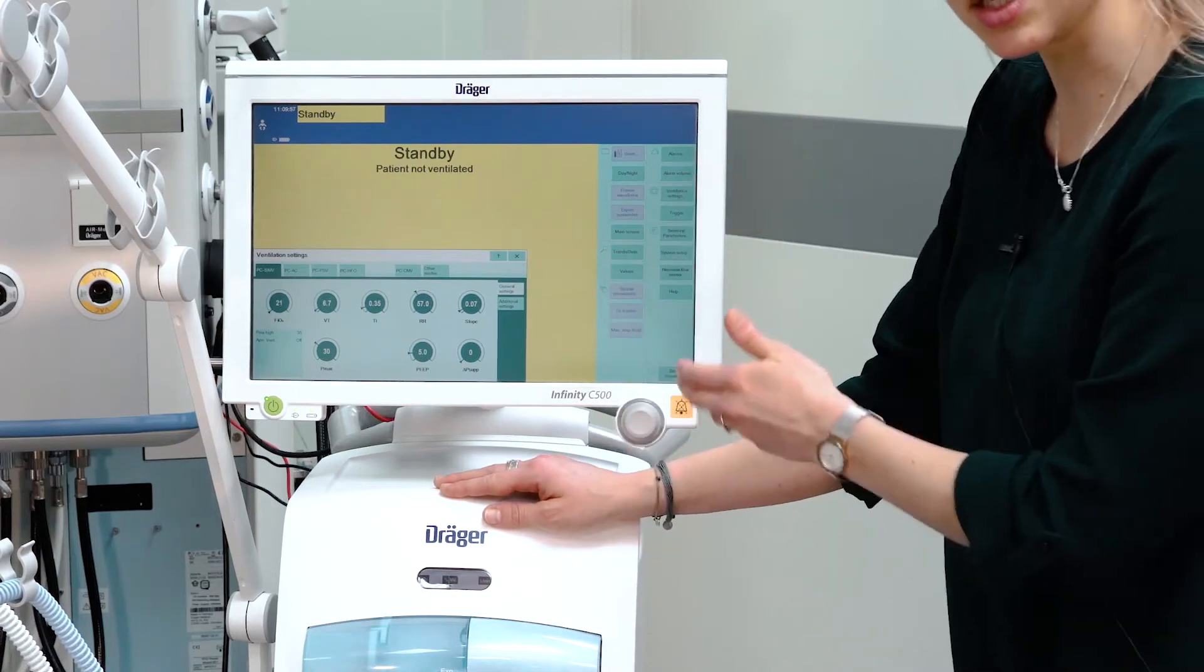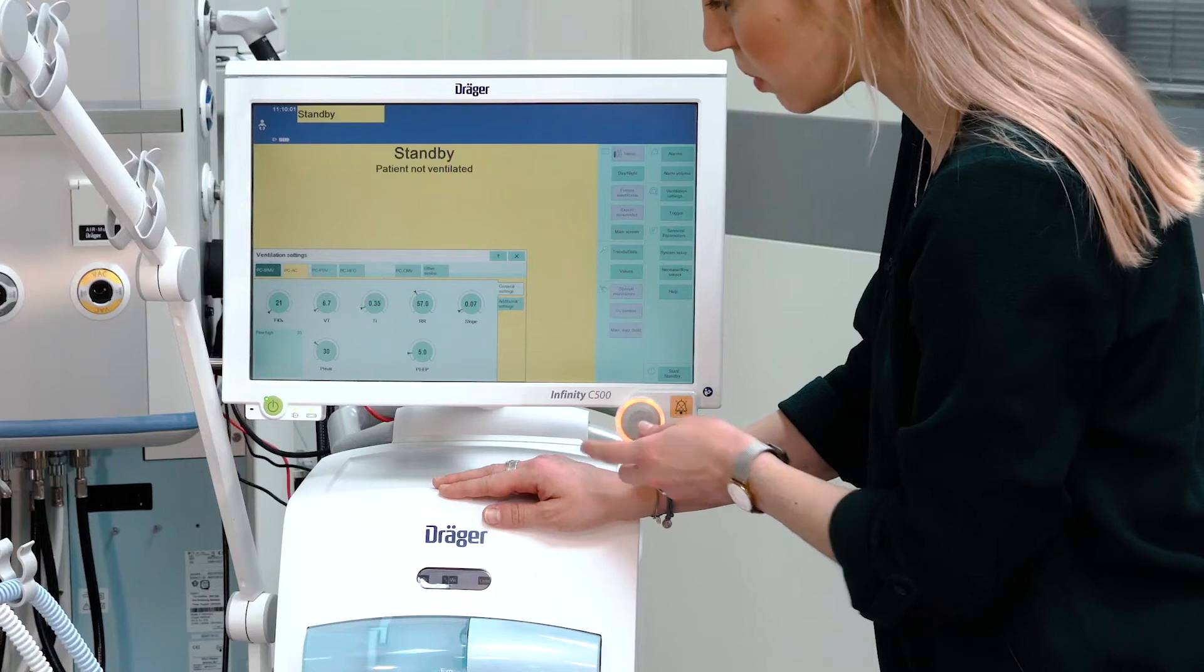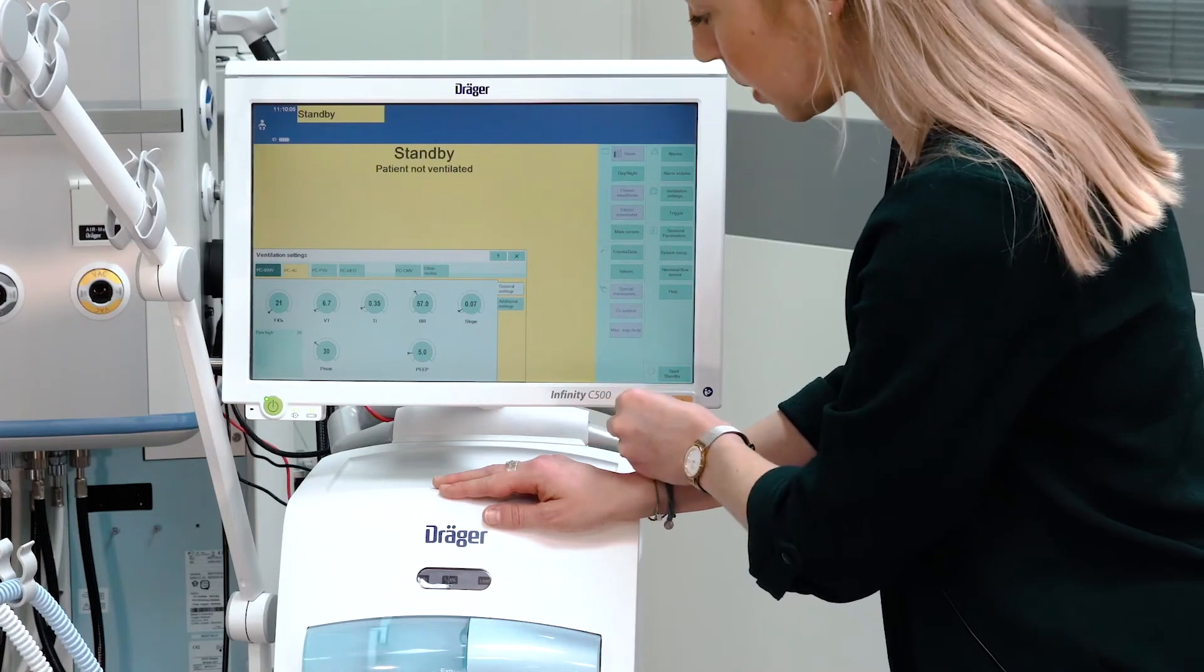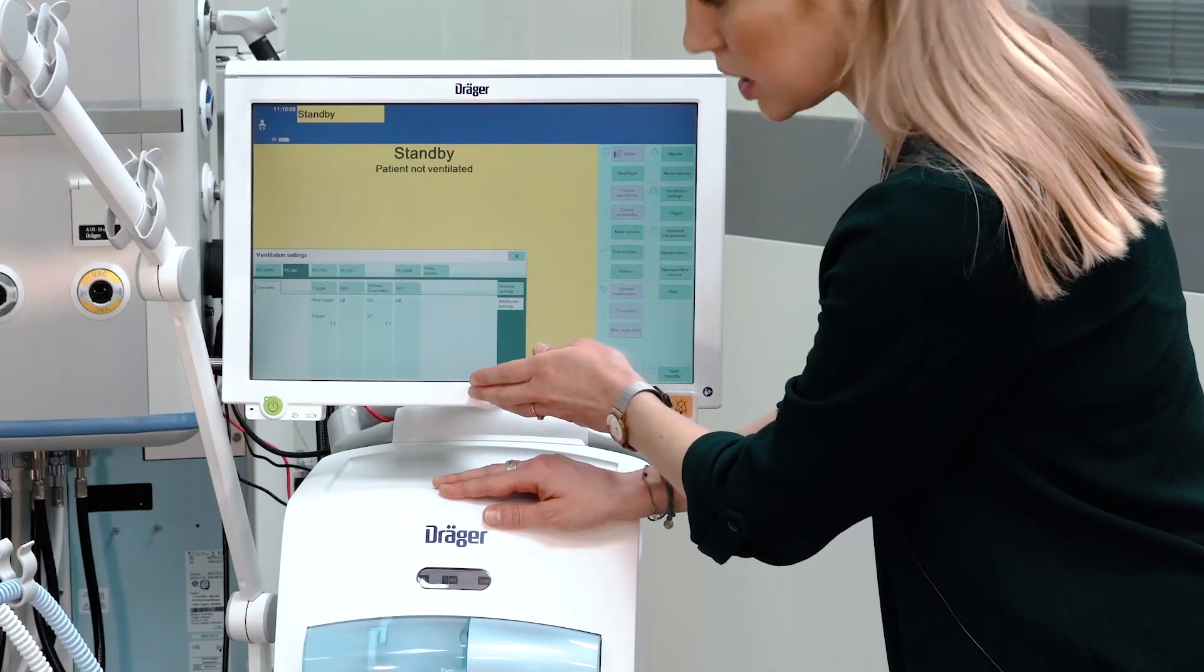If you want to start in a different ventilation mode, please select the respective ventilation mode, make sure that the settings are all correct, and confirm by pressing the rotary knob. You can choose additional settings over here.